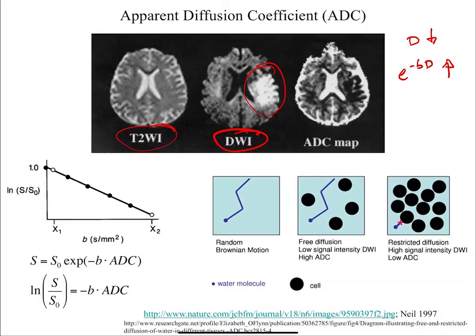Yeah. If you've just been hit by a car and you're hemorrhaging, they won't even do an MR in general. They'll just get you to a CT. So if you're very close to death, they'll put you in a CT and get the scan just to look for major damage. Because if you're really that damaged, they're just going to get into surgery as soon as possible. So they just want a 5-minute scan, you're in and out.